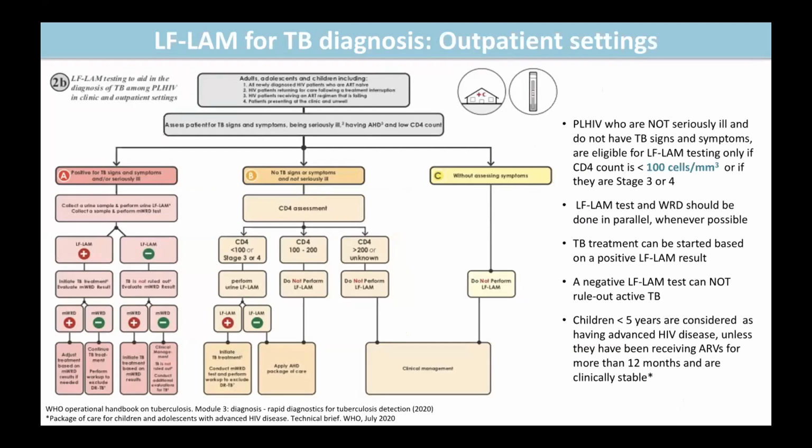The main thing to highlight here is that for patients presenting in outpatient settings without TB signs and symptoms and not seriously ill, the CD4 threshold is below 100 rather than below 200, which is what has been chosen as a threshold for the patients presenting to inpatient settings.